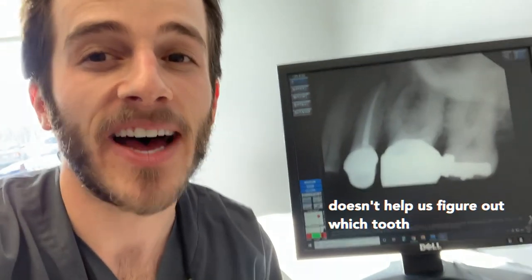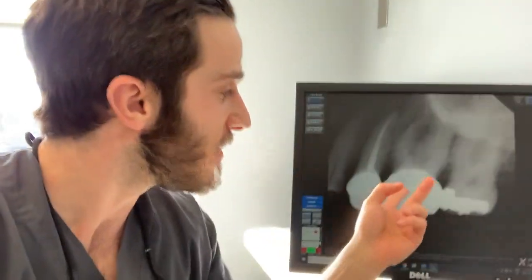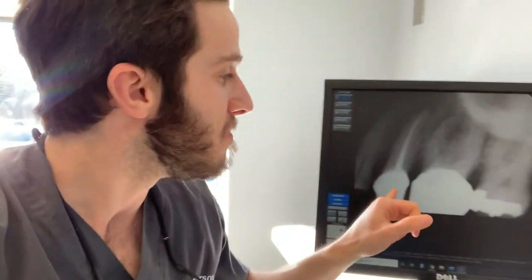That doesn't really tell us a lot. Now, both of these teeth have been crowned, so you can't apply a cold stimulus to this first molar and see if it can still feel the cold. So that's out as a diagnostic technique. Now, another technique that we have is to tap on the teeth. Both of these teeth, when we tap on them, respond negative. This is a challenging case because radiographically, both of these teeth present with a potential infection above them. Diagnostically, intraorally, we can't use any techniques to differentiate them.